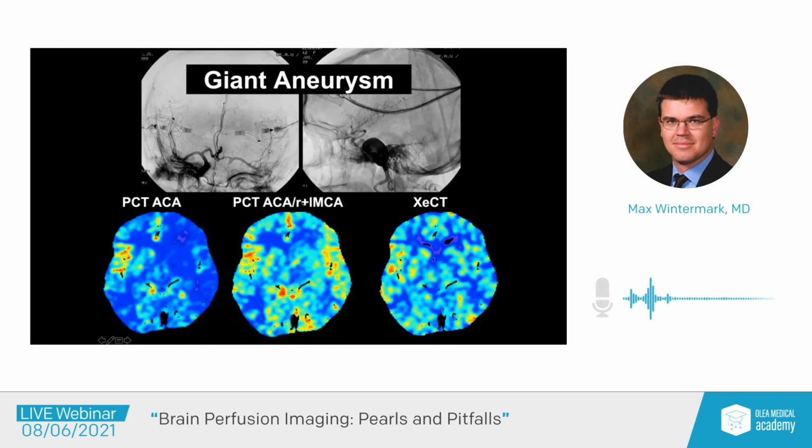If you use a delay correction process, or if you use multiple arterial input functions, you can see that again, there's this delay. But once you correct for the delay, once the contrast finally gets out of the washing machine and makes it to the vascular territories, the dynamic of the contrast in the vascular territories, in the capillaries, is normal. And as a result, the CBF is normal.